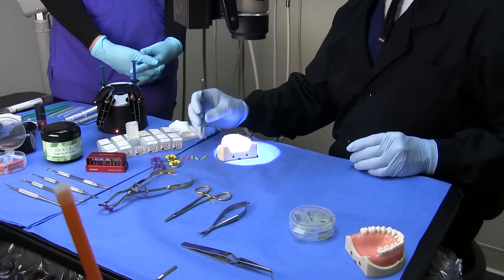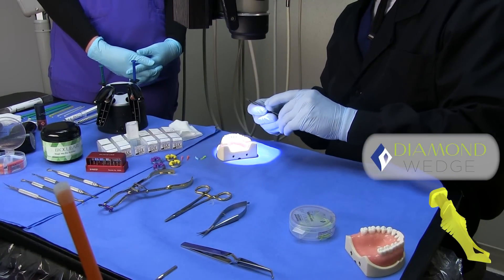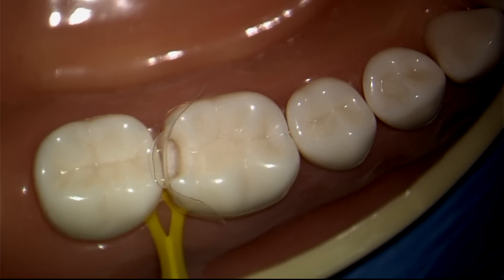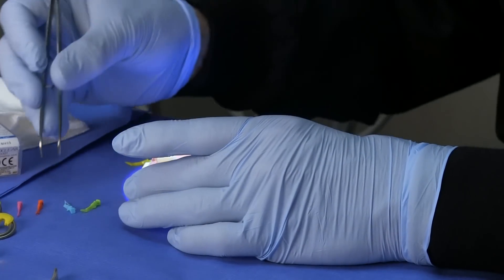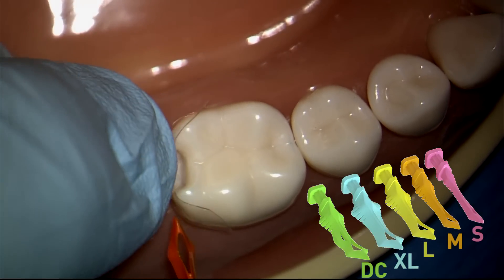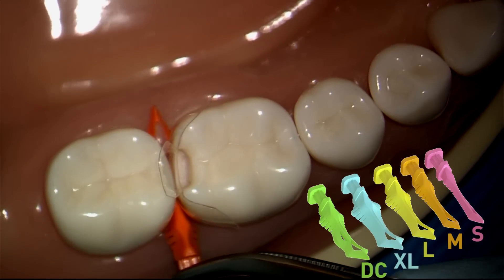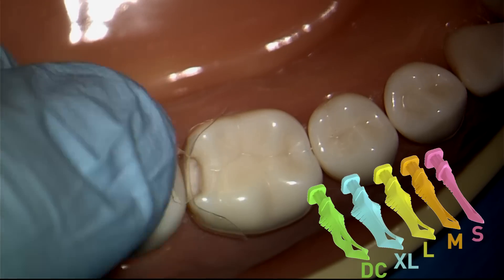My favorite wedge for most restorations is the large wedge. It looks a little bit too large for most areas, but because it collapses as you insert it, this is my go-to wedge. I'll start with the medium wedge and you're going to see that it slides in a little bit too easily. I'm going to hold the matrix down with this finger so that it doesn't slide. This is not doing a lot of work, so don't be lazy — let's move to the large wedge.